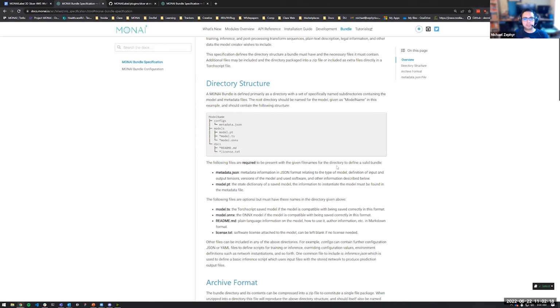So maybe you skip that MONAI core. Maybe you don't need to train your model any more after you're done with your annotation within MONAI Label and you're ready to deploy. We're trying to make it easy for you to take that and go over to your deployment platform and deploy it over there, or whatever you want to do with it afterward. So I wanted to mention that briefly.